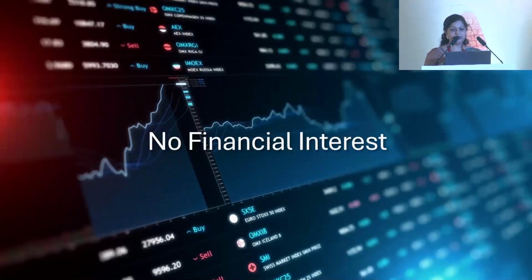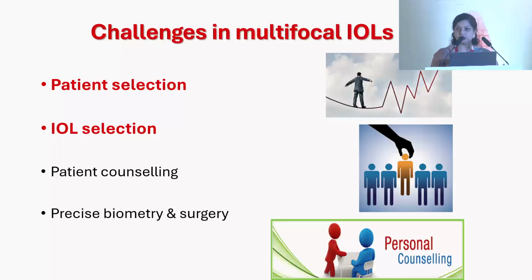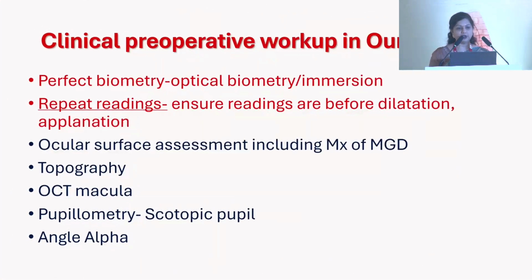Yeah, so no financial interest in any of the products. Today as ophthalmologists, we want to give more and better vision at all distances to our patients, but we need to remember that the challenges are not only a good surgery and good counseling, but also good patient selection and the perfect IOL selection.